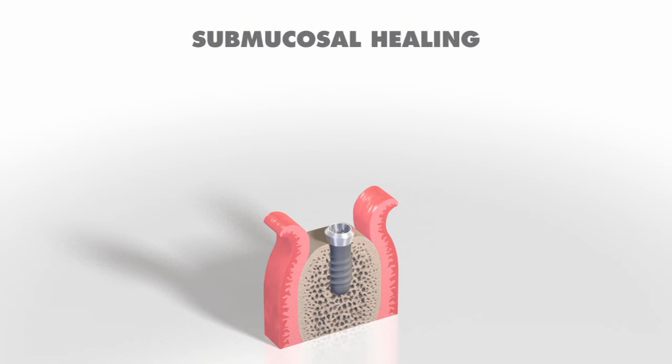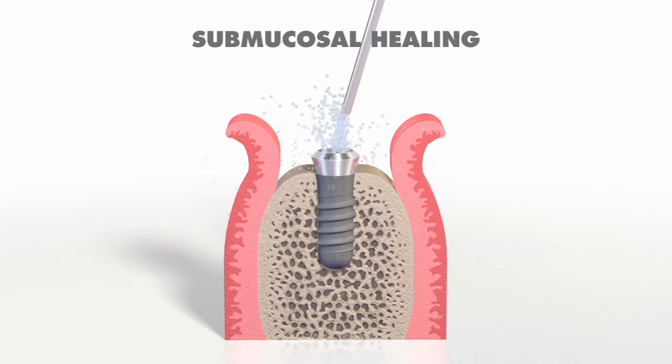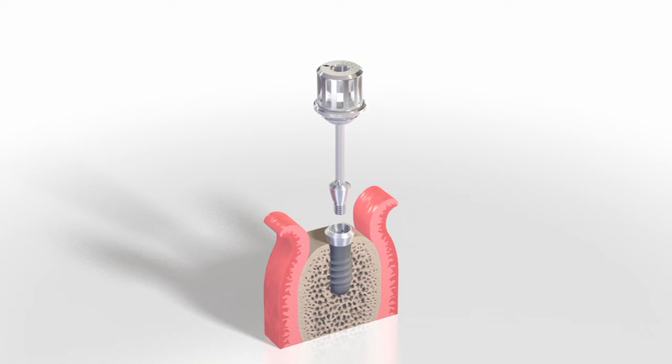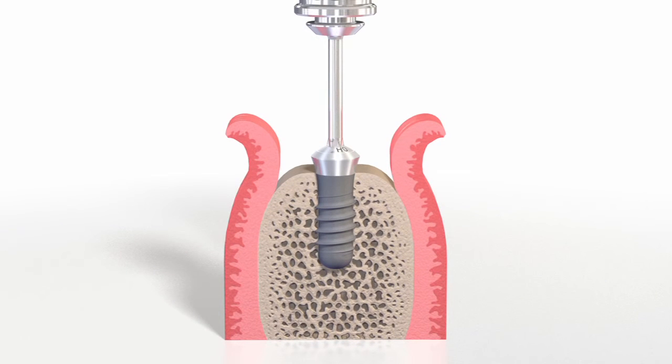For submucosal healing, it is recommended to use a closure screw or a short healing abutment. Before the closure screw is inserted following the first surgery, the internal configuration of the implant must be clean and bloodless. The SCS screwdriver is used to pick up the closure screw. The friction fit secures the closure screw to the screwdriver during insertion, thus assuring safe handling. The closure screw is tightened by hand.